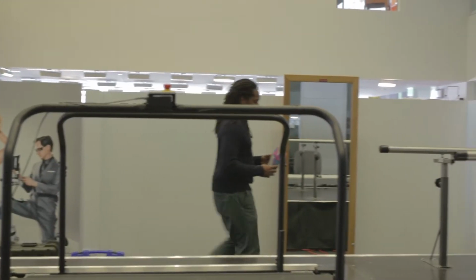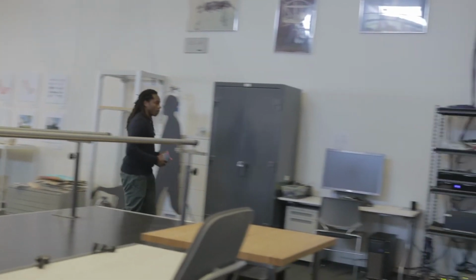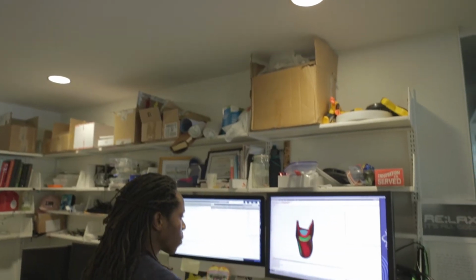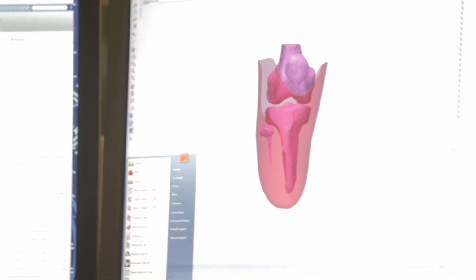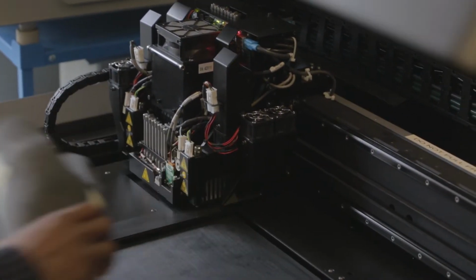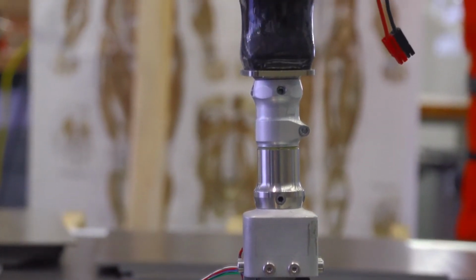So the great thing about the prosthetic socket we've designed is that it uses data and areas of expertise from 3 or 4 different fields. Medical imaging, because we use MRI to capture the data, mathematical modeling, design, and we use that data to design the prosthetic socket that we have, and manufacturing. We 3D print the designs that are multi-material and test it with the patients as well.